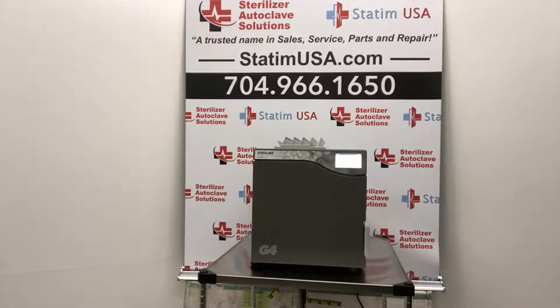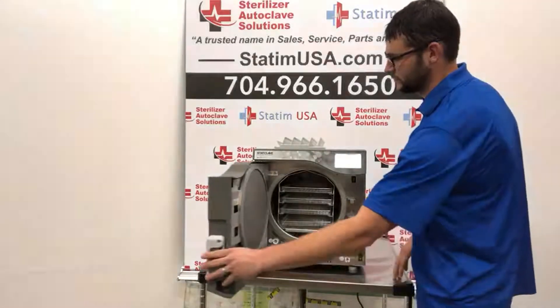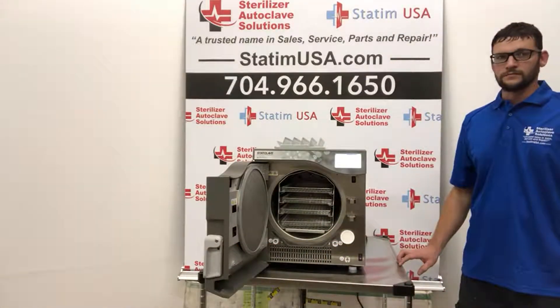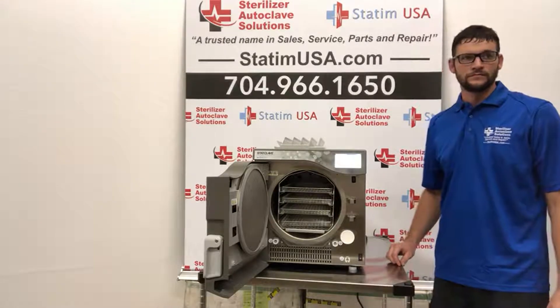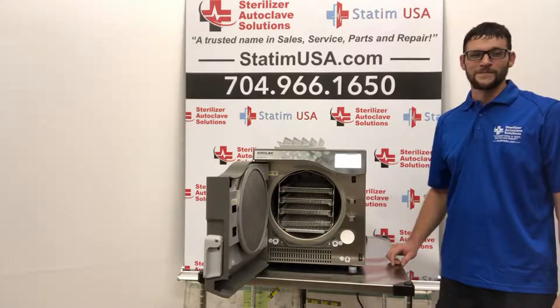Heads up, medical community, as regulations are coming and closed-door drying is the future of sterilization. The StatClave G4 has an 11-inch chamber and can sterilize up to four full-size cassettes and four exam cassettes, or up to 20 pouches. It can sterilize a remarkable 14 pounds of equipment at any given point in time.